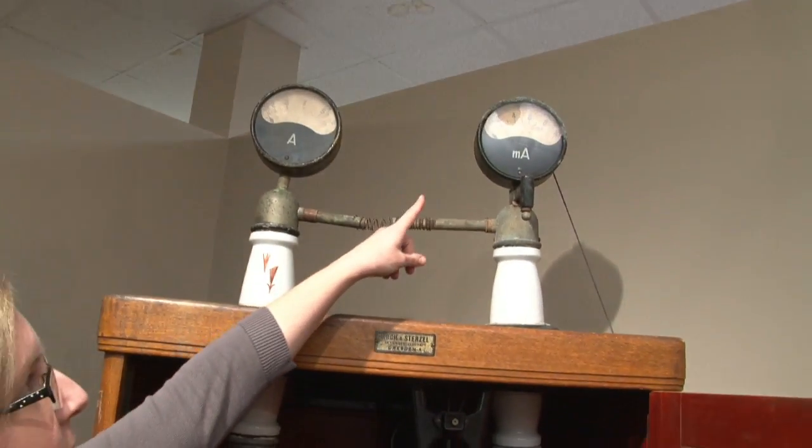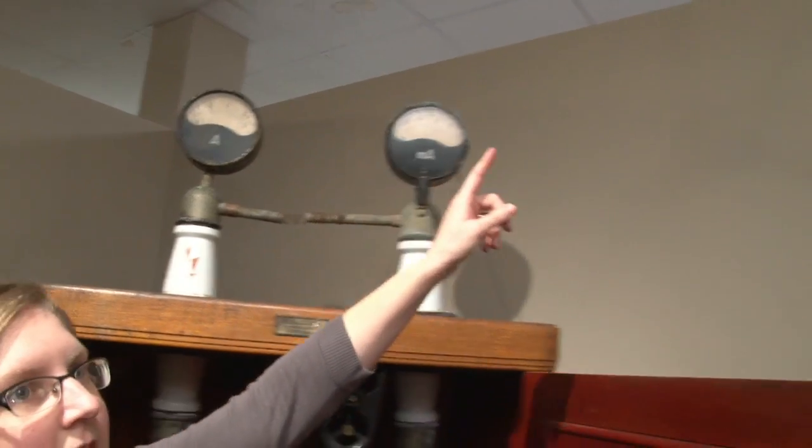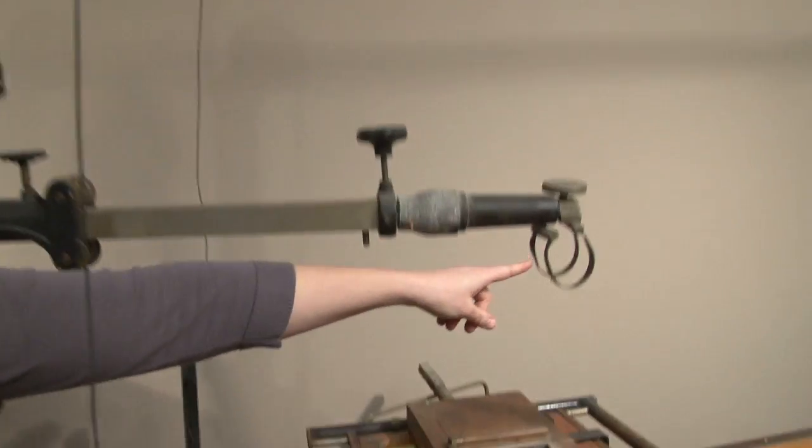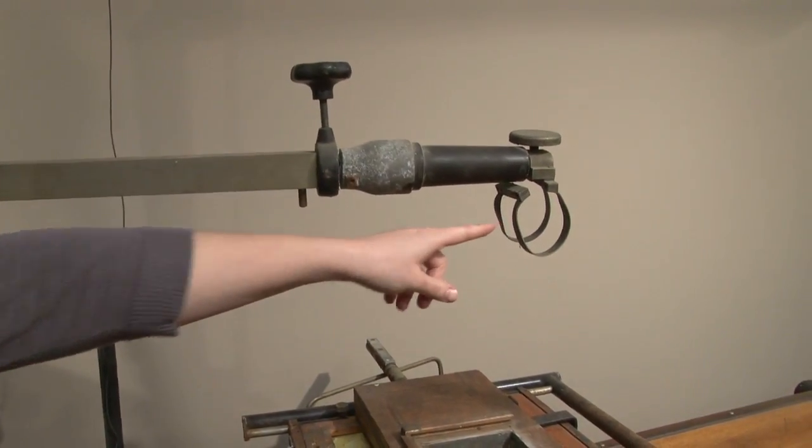The electricity would have flowed from the top of this cabinet across taut wires to these insulated arms and then down to the x-ray tube, which would have been mounted here on this adjustable arm.